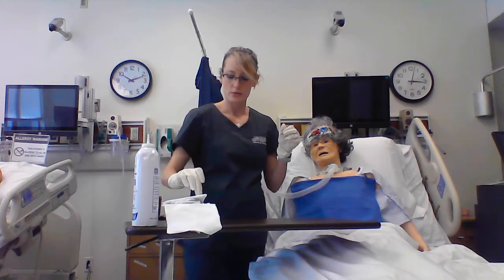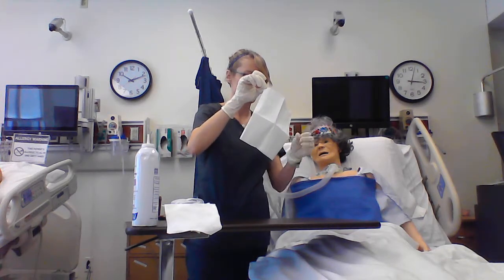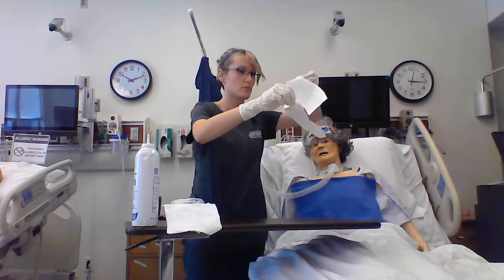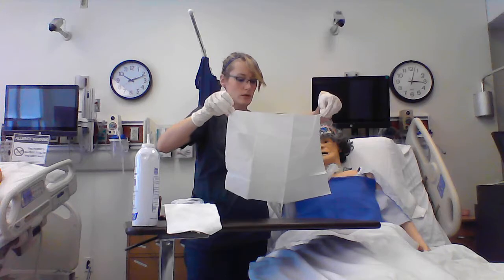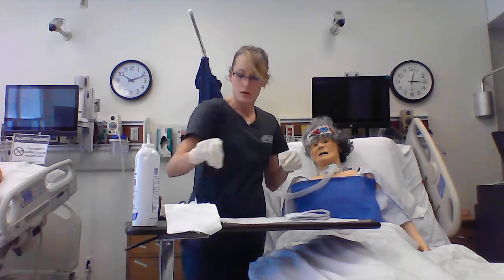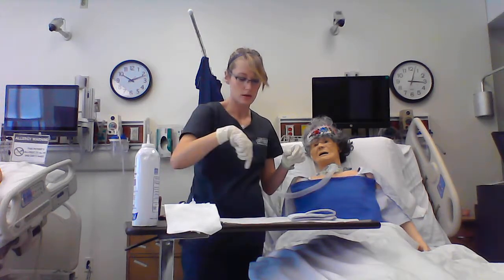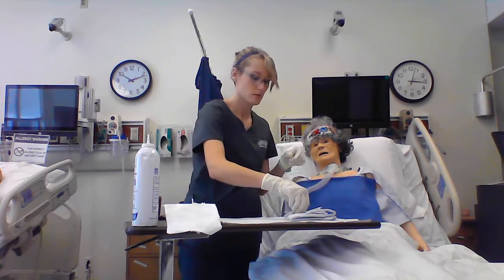And you can begin setting up your sterile field. So pull your drape. Mind your 1-inch border on this as well. You don't want to touch it with anything other than your sterile gloves. And set up your sterile field any way that you like for it to be, minding the fact that that outer border is considered non-sterile.